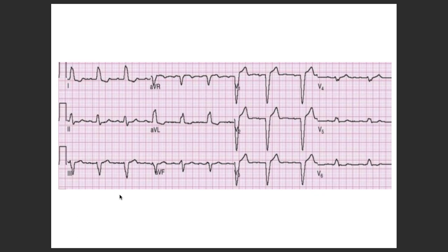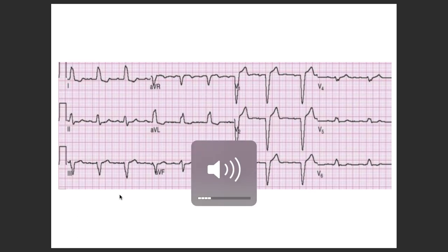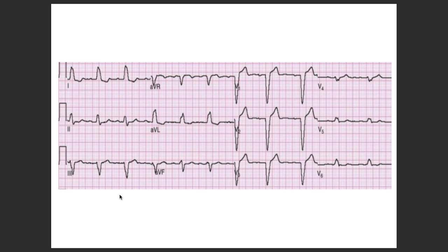Okay. And see, in medicine your diagnosis should never be dependent on just one thing. It should always be supported by other evidence as well. So for example, when do you call it VT? I'm so sorry, I'm diverting again from the topic because I want you all to have a good comprehensive overview as well. When do we call it VT? Simple. Absence of P and broad QRS complex with tachycardia. Please use the chat box. There are some students as well, as I had said. Okay. Please use the chat box. So when do we call it VT? Yeah, wide QRS complex. So simple things.